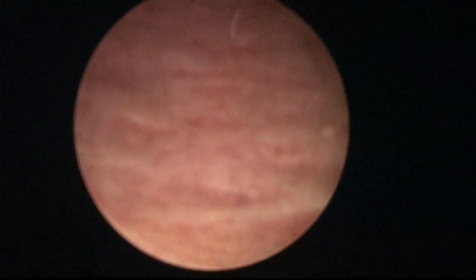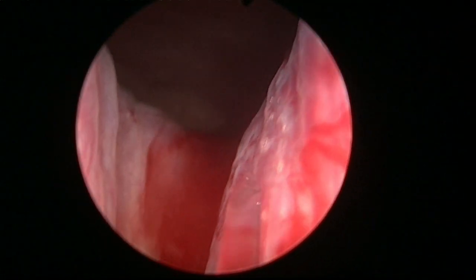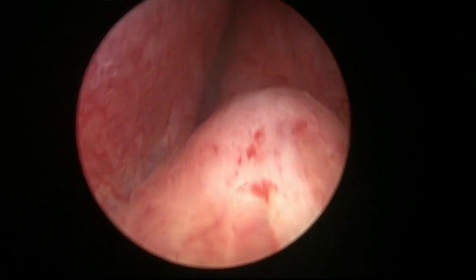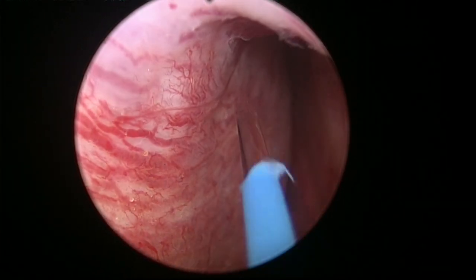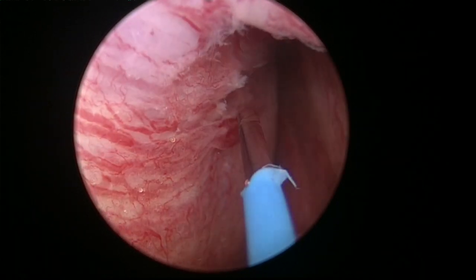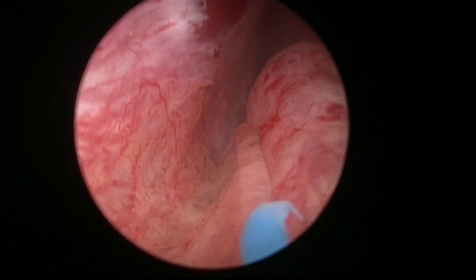So, let's put the fiber in. That's the barrel again, and here you can see the edge of the sphincter, no? Here, I'm going to mark the white line, huh? So I'm going to try to develop this white line. There is some mucosal bleeding, it's quite common.